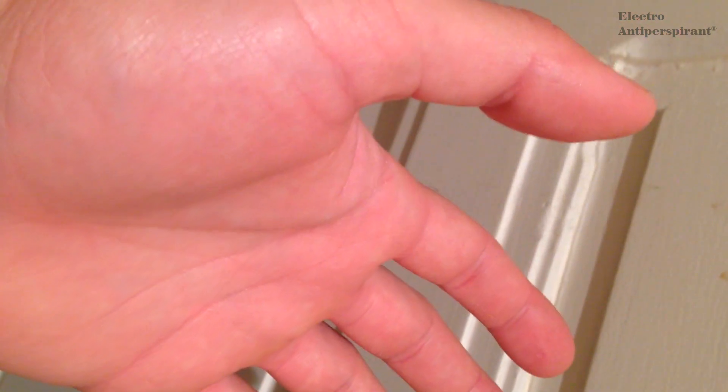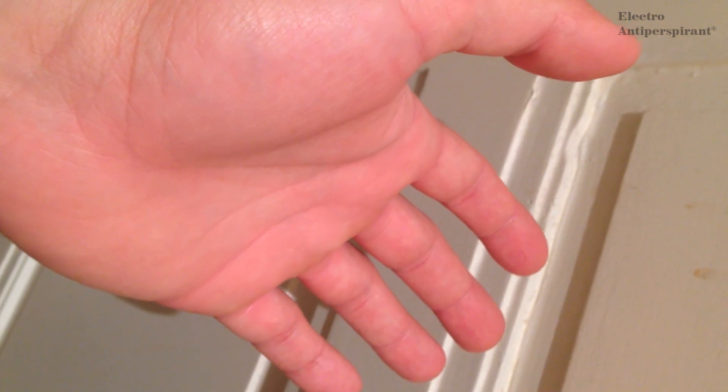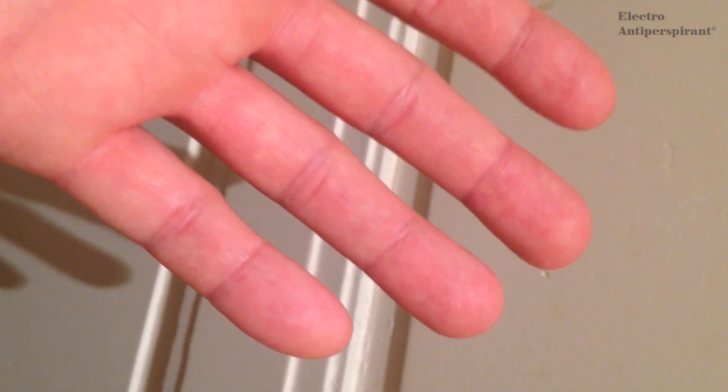And as you can see, the sweat is absolutely gone. No sweating. Absolutely no sweating. So I think electroantiperspirant works perfectly and I must recommend it for everybody. Absolutely no sweat anywhere.